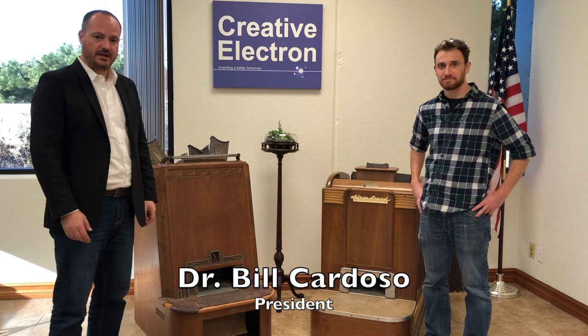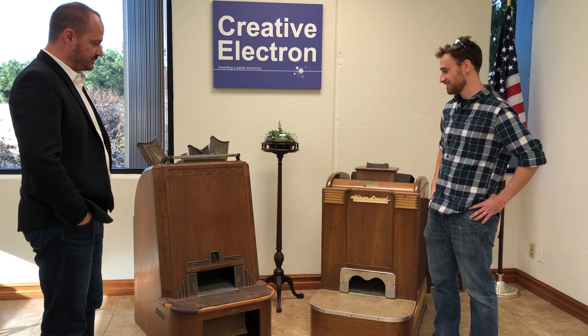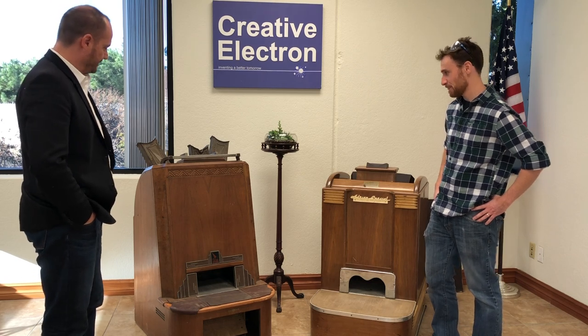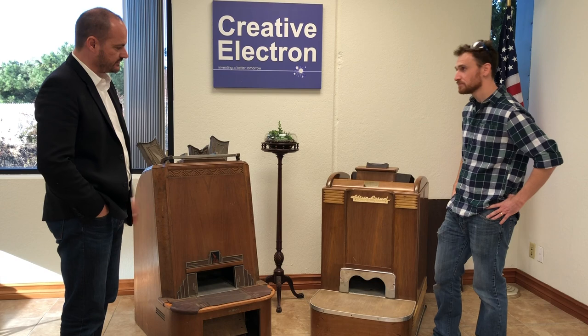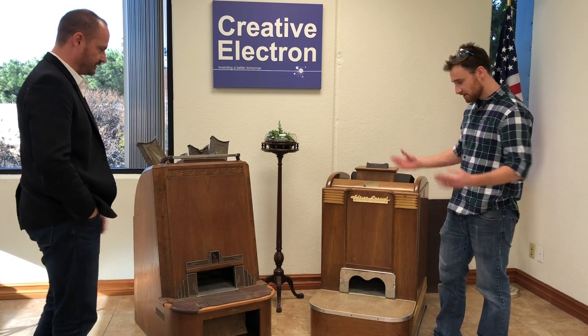Hello, I'm Bill Cardoso with Creative Electron. I'm Griffin LeMaster. We're just going to show you a couple of pieces that we have in our museum that we really love. This is the Adrian Special Shoe-Fitting Machine. These are a couple of examples of the early days of X-ray inspection. This system here is from the 1920s, and that machine is from the 40s. Griffin, why don't you tell us what it's supposed to do?